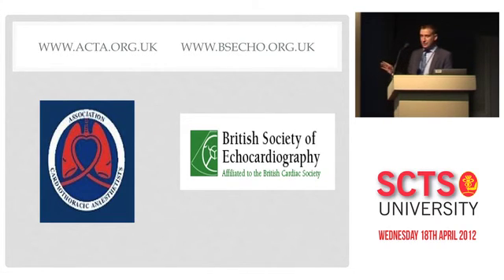And I think the third point I really want to make, which comes from that, is if you're seeing something unusual in the heart, particularly something like a mass, and you're not sure what it is, always go back to previous studies, go back to the outpatient studies that the patient had. They're all available on Medcon now, and describe what you're seeing in association with that.